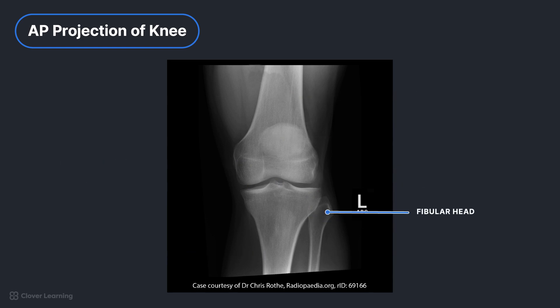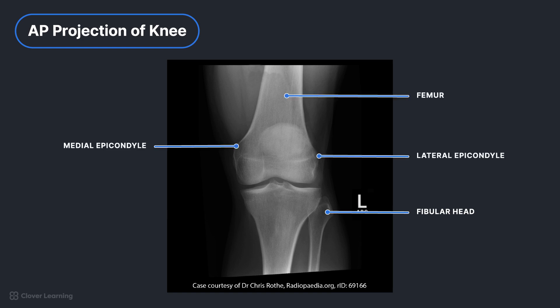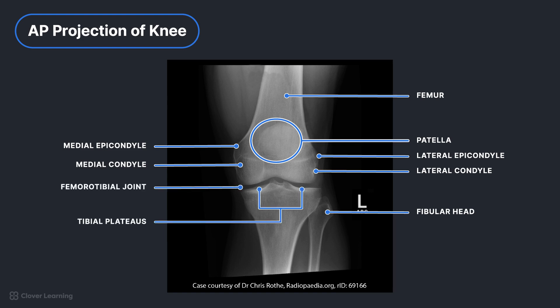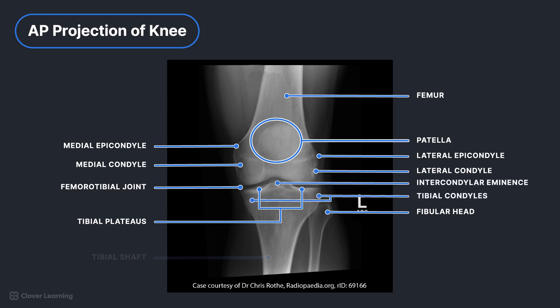Can you identify the anatomy? Working from superior to inferior, we can clearly identify the distal femur, medial and lateral femoral epicondyles and condyles, patella, femorotibial joint space, articulating facets of the tibia or tibial plateaus, medial and lateral tibial condyles, intercondylar eminence, shaft of the tibia, and head and shaft of the fibula.